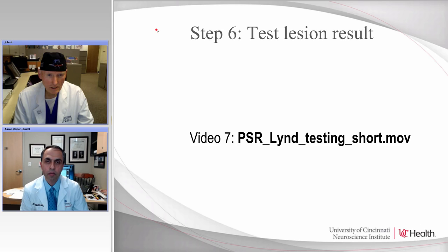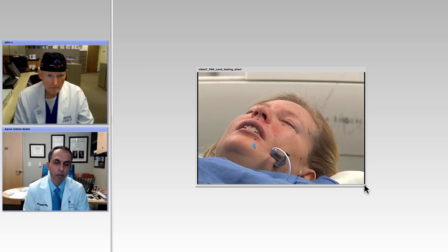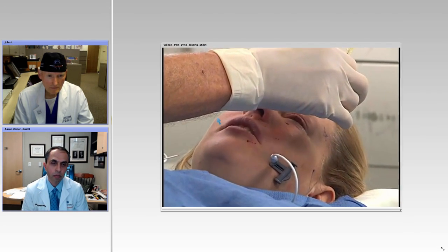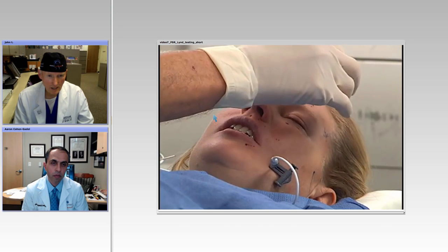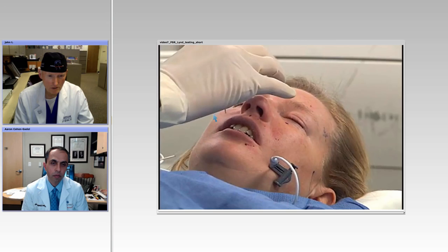So let's look at the lesion testing one more time. So this is the type of test. She's telling us that it's normal in the first division.